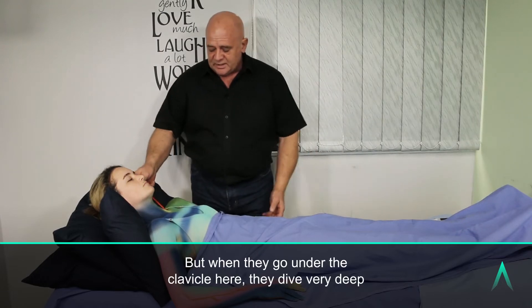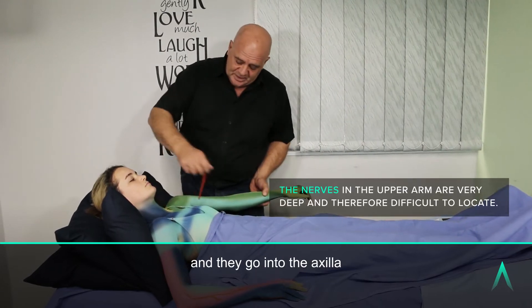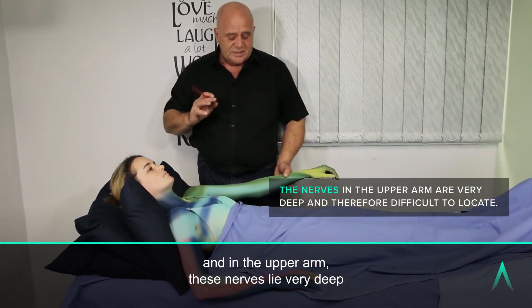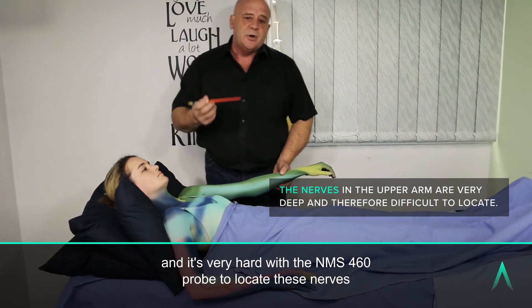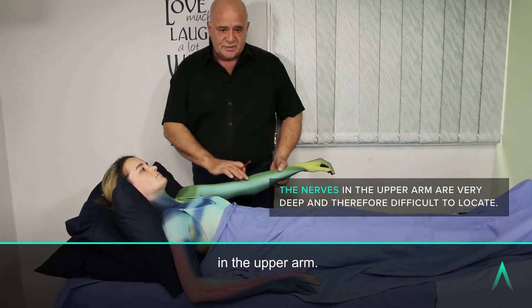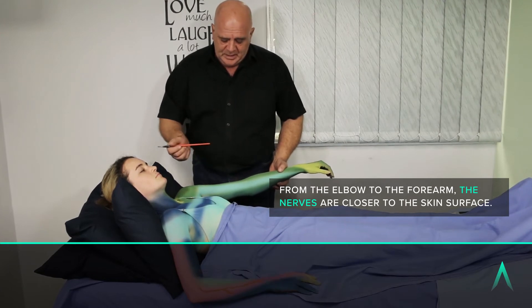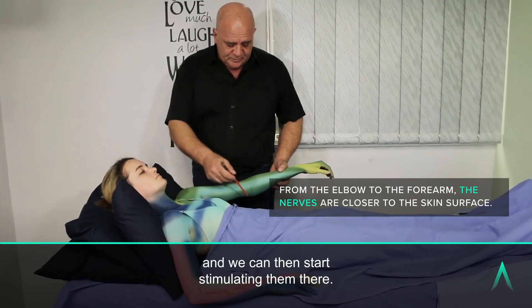But when they go under the clavicle, they dive very deep and go into the axilla. In the upper arm, these nerves lie very deep, and it's very hard with the NMS 460 probe to locate these nerves in the upper arm. Once they get to the elbow, they start surfacing better, and we can then start stimulating them there.